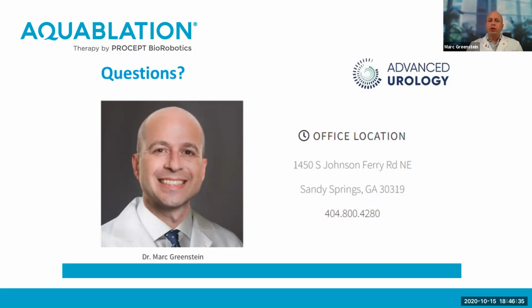So like I mentioned in one of the previous slides, the catheter times are usually catheter definitely overnight. Everyone has a catheter for a minimum of 48, if not 72 hours. In the study that we did here, we studied our first bunch of patients, and I think we had some patients where the maximum catheter time was about 5 days. But almost everybody's getting a catheter out in about 48 to 72 hours. And like I said, the catheters are annoying. My staff will help you with it. We'll give you medicines to calm down the irritation from the catheter so that everything gets better.